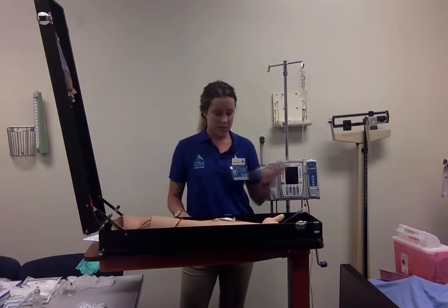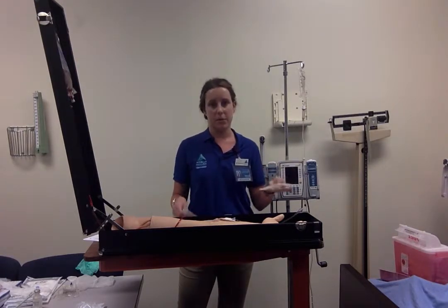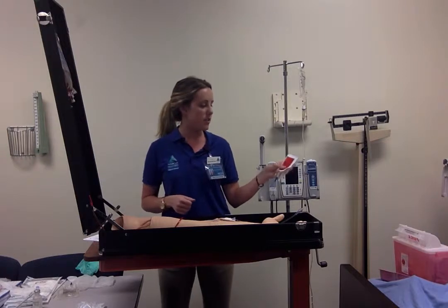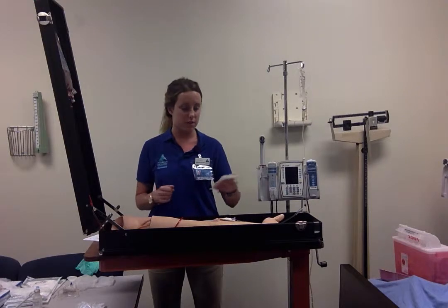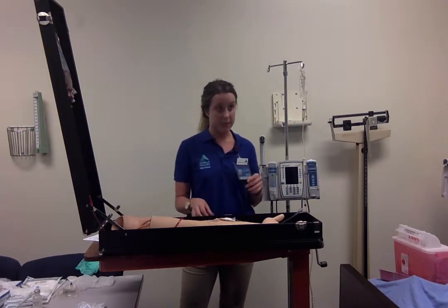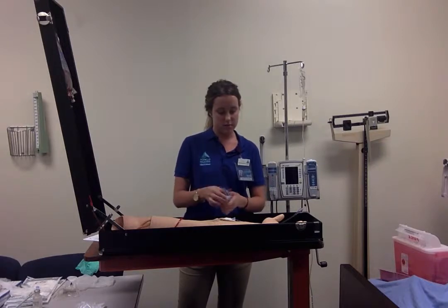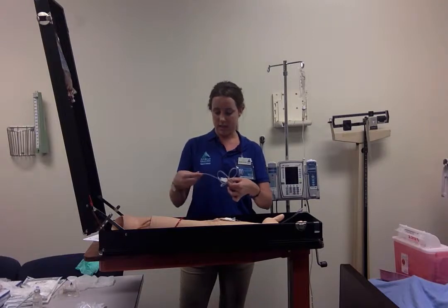I'm going to make sure the contents are all shaken up and mixed together. And I'm going to put a label on this. I'm going to make sure I have the drug, my initials, the date, the time, the expiration date, the patient's name, and the flow rate, which is 17 drops per minute. So I'm going to leave this here. And I'm going to get my tubing, and I'm going to attach this to the mini bag.